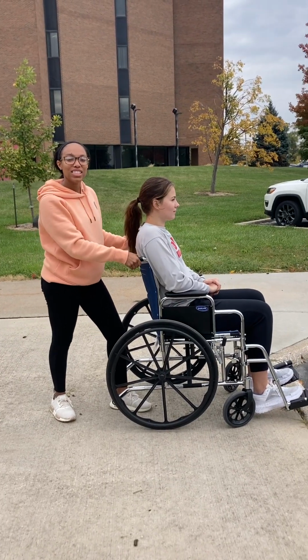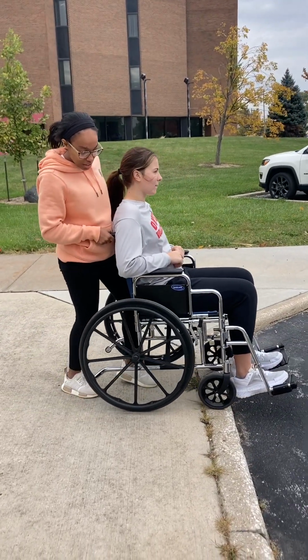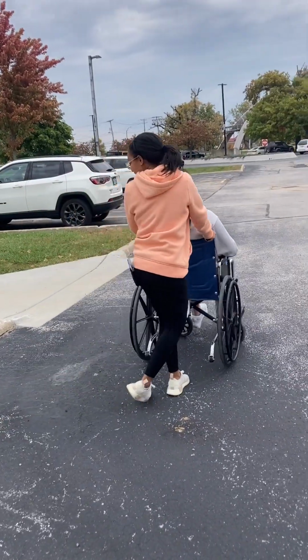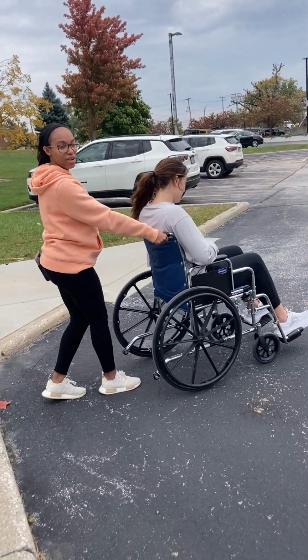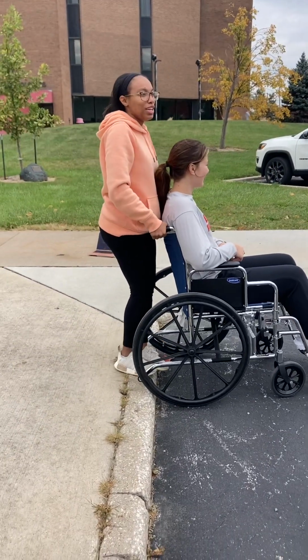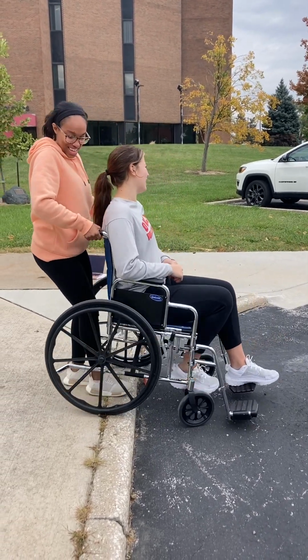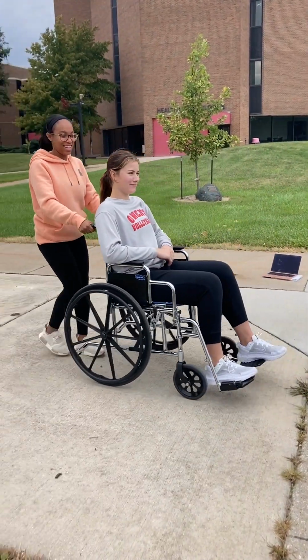Okay, so now we're gonna do descending forward. We're gonna slowly go down. And now we're gonna do ascending backwards. So you get to the edge, you're gonna wanna lift up, over, and then pull to go over.